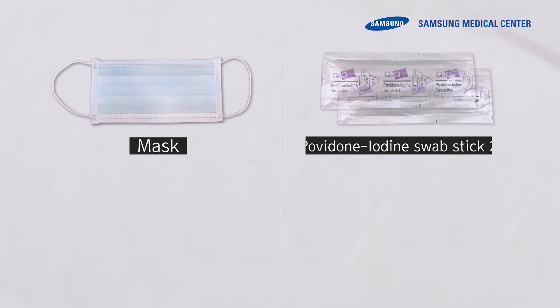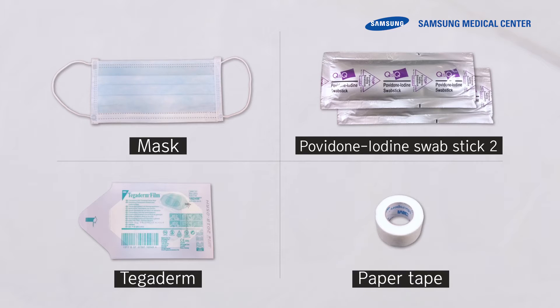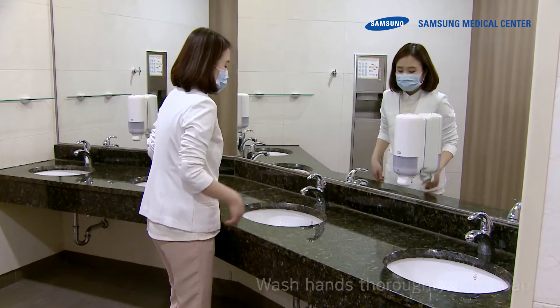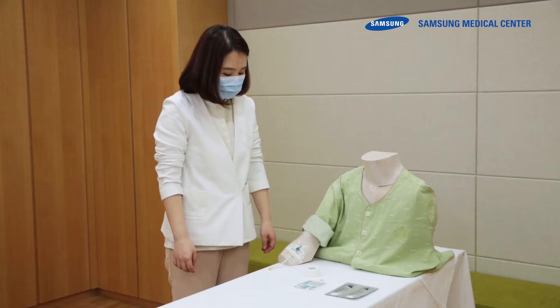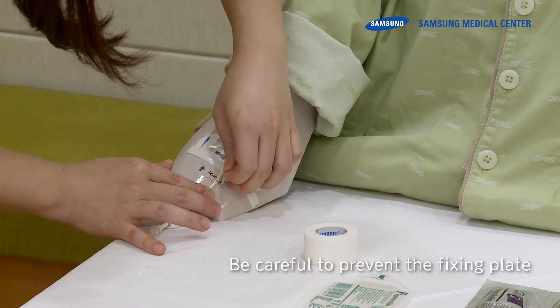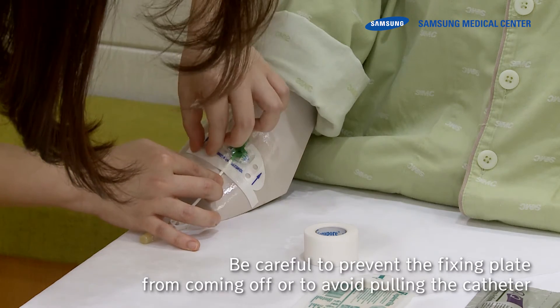First, have a mask, two sterile swabs, Tegaderms, and a tape ready on a clean towel. Two swabs are placed in a bag of sterile swabs. Wear a mask. Wash hands thoroughly with soap. Then take off the attached Tegaderm, being careful to prevent the fixing plate from coming off or to avoid pulling the catheter.